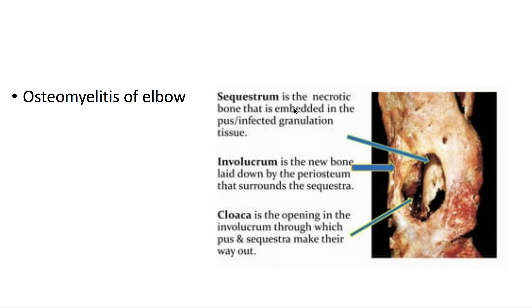This is a case of osteomyelitis of the elbow. As seen on imaging: the sequestrum, which is the necrotic bone embedded in pus-infected granulation tissue; the involucrum, which is the new bone laid down by the periosteum that surrounds the sequestra; and the cloaca, which is the opening in the involucrum through which pus and sequestra make their way out.